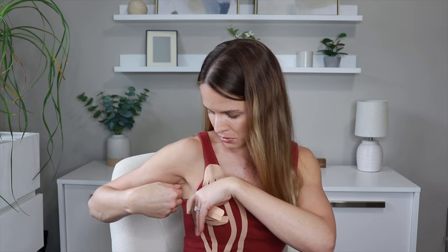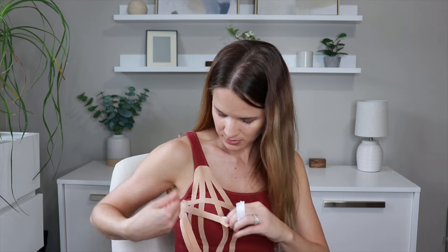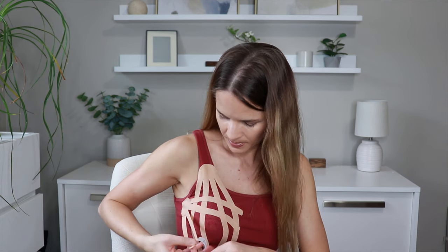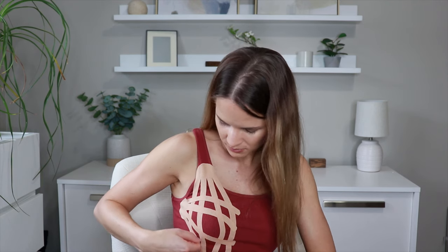Some individuals will also place another piece below. I've already cut a strip here — pull back the one or two inch anchor and place it below, kind of at the inner part. Then same concept: peel back each strip, guide it with slight tension, and lay it down without tension at the end. The third and fourth strips will go a little lower, directing them around the areas that you need it. That's another option if someone wants more coverage, generally guiding fluid towards both the upper and lower armpit, just to give more coverage as needed.